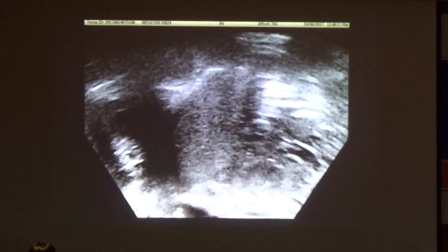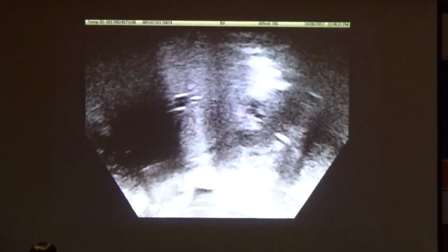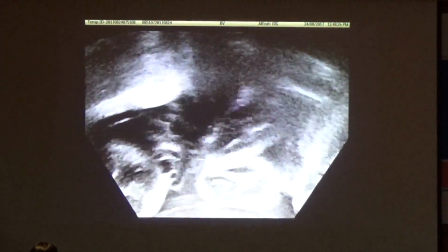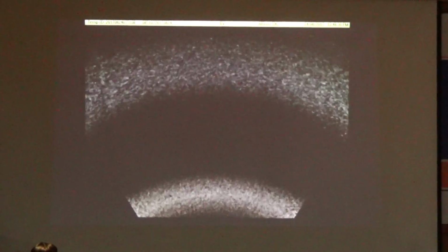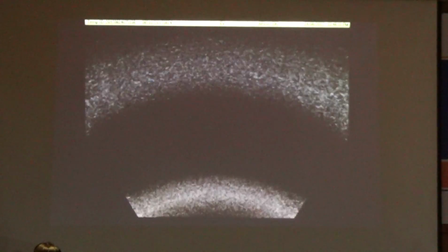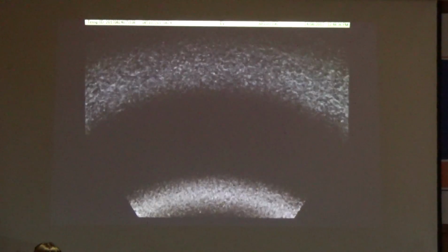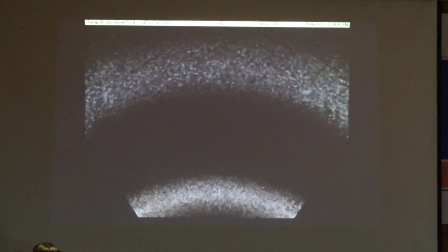You know, 37 weeks is very difficult to start seeing everything. And this is what happened yesterday. They bring you patients at 37 weeks and, you know, you can't get the baby in the right place. But I would just say this. This is transposition. The pulmonary artery definitely comes off the left ventricle. It's large. And the ductus is giant. Okay?